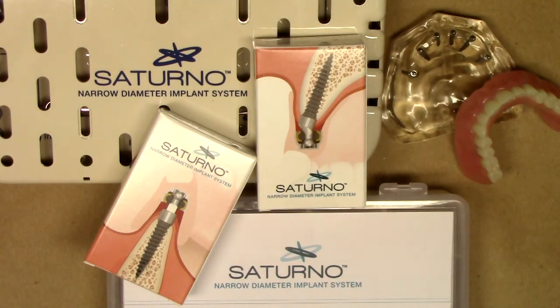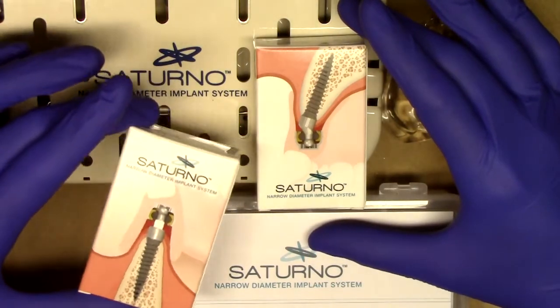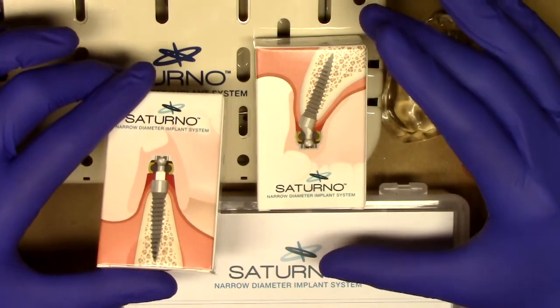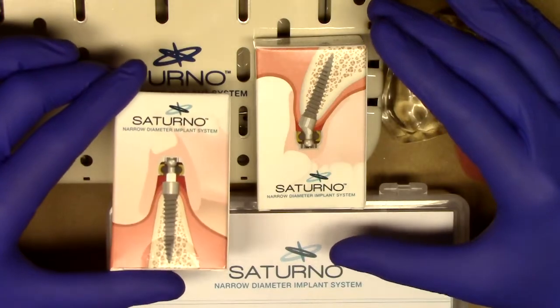Look for follow-up videos to include treatment planning and drilling sequences and placement of Saturno narrow diameter implants. First and foremost, I'm going to describe everything that you see in front of you. What we see here is our implant packaging, very similar to what you have been experienced and are used to with Lodi, the locator overdenture system implant.